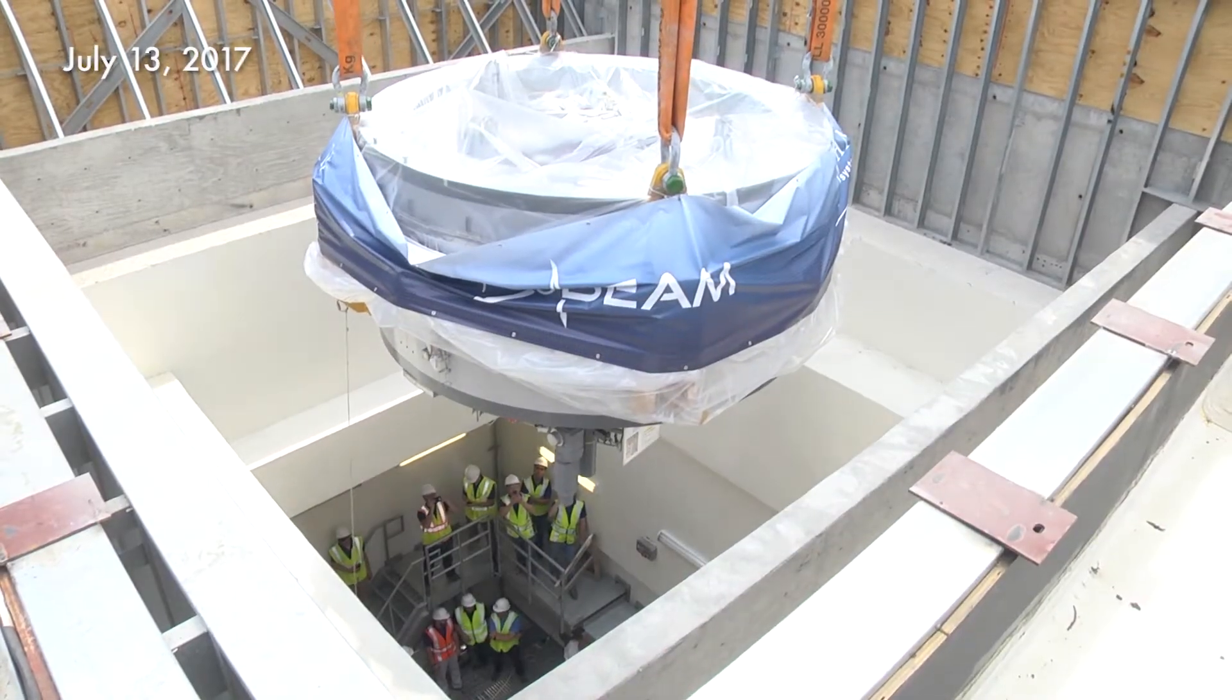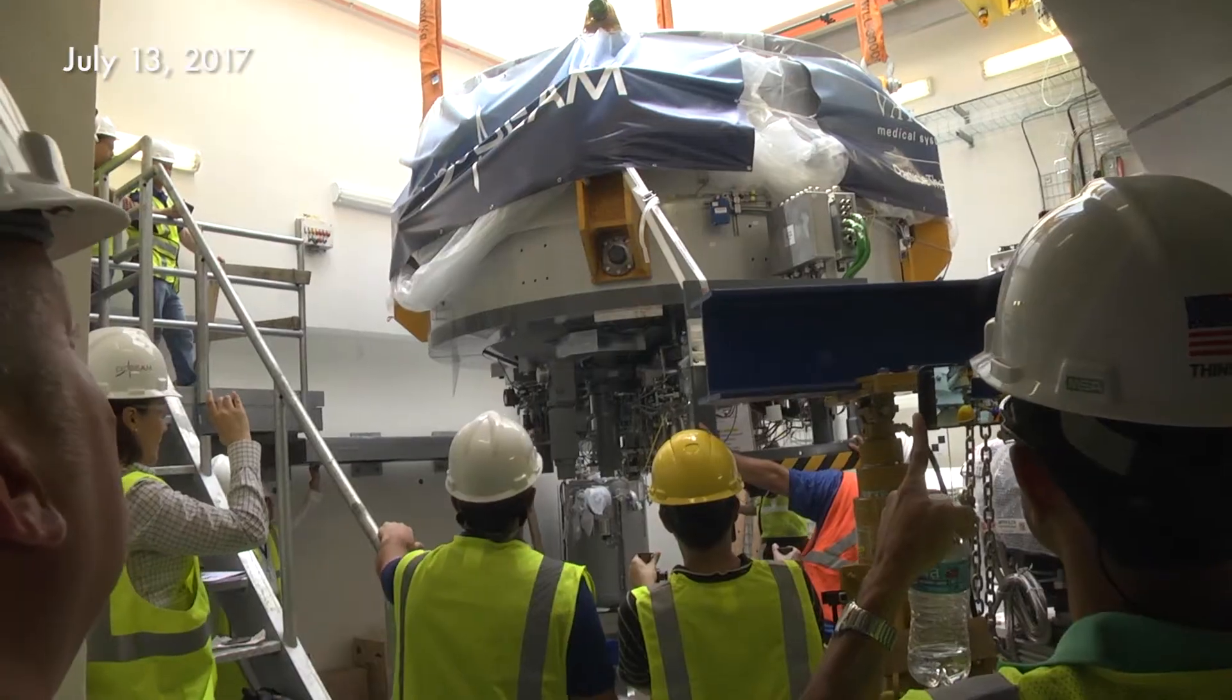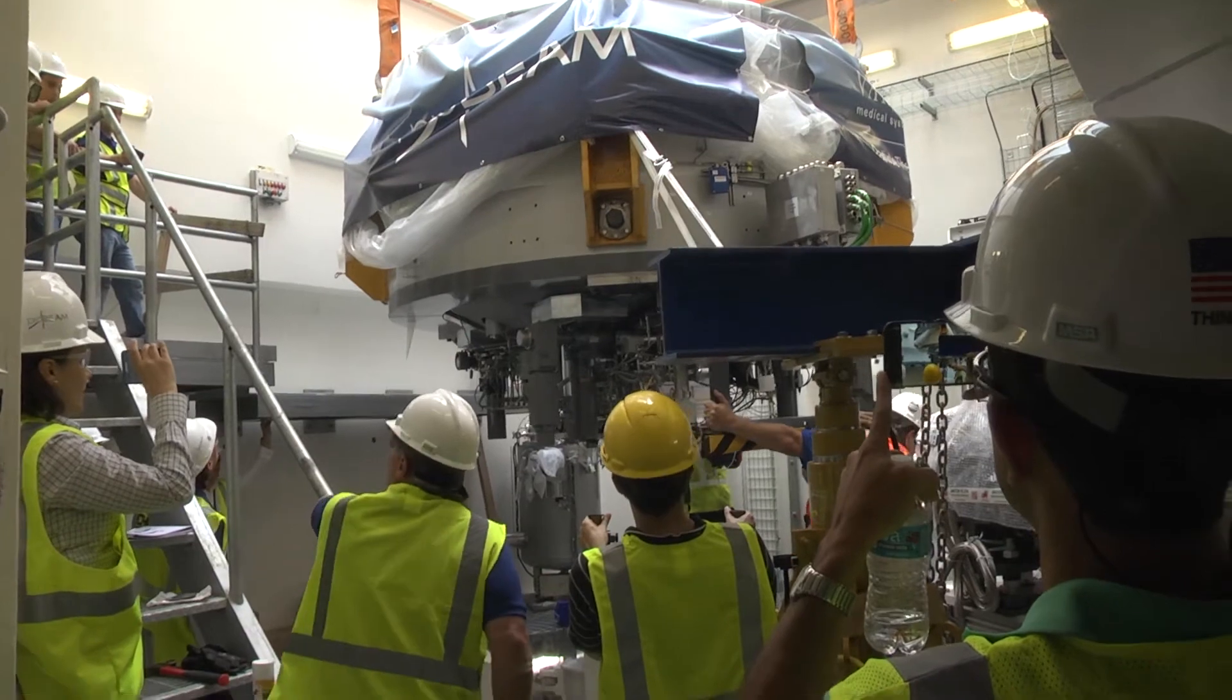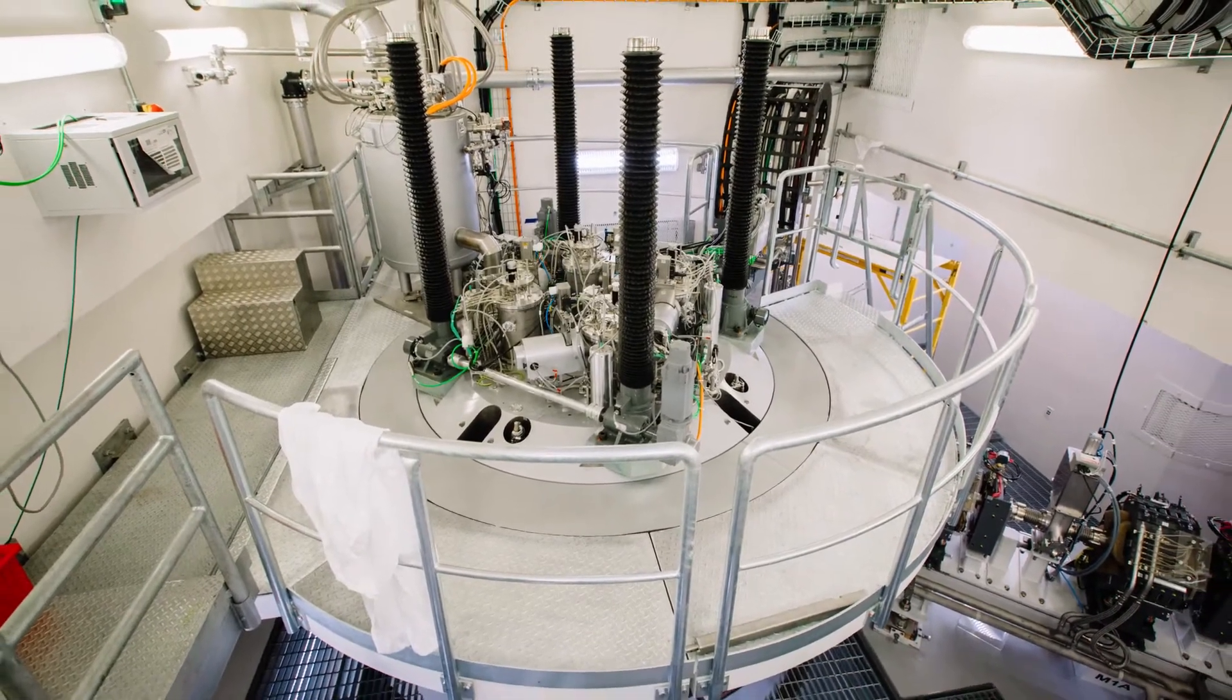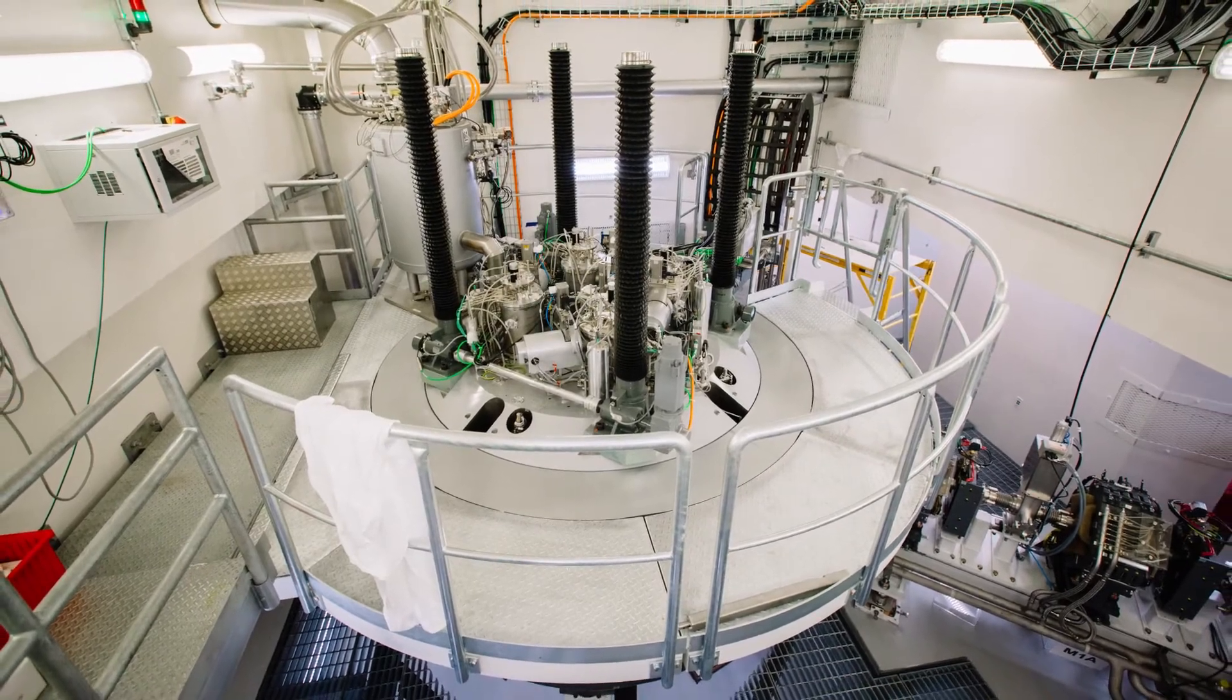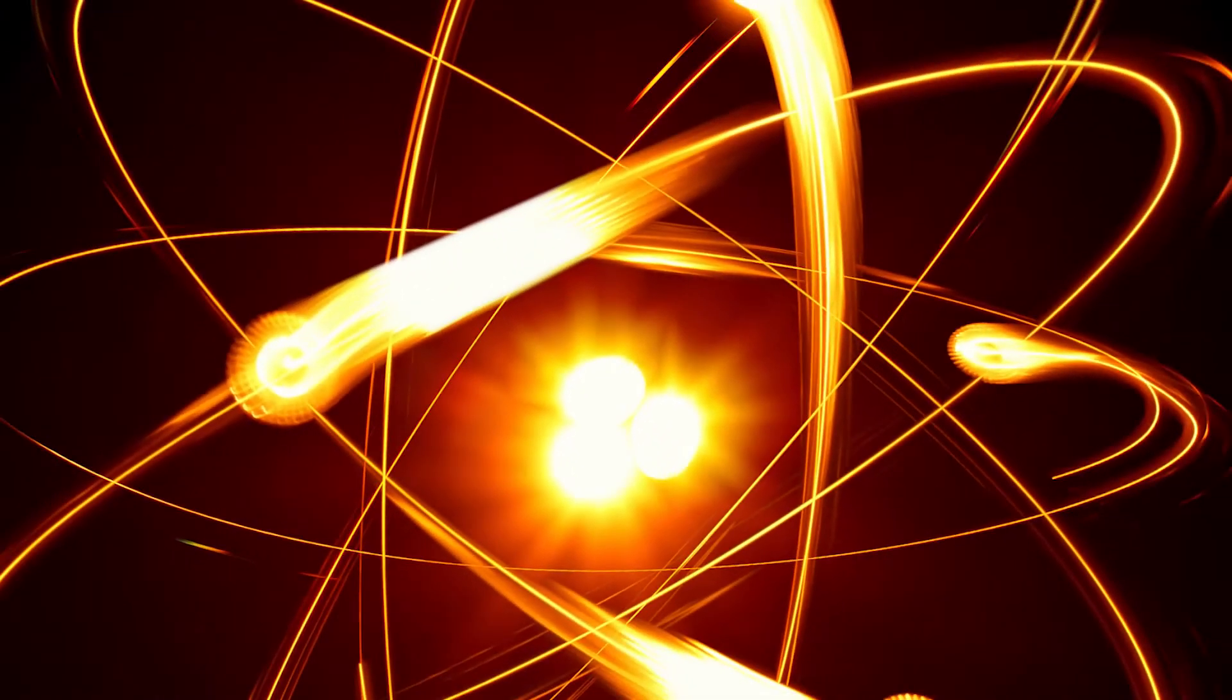This is the state-of-the-art superconducting cyclotron. The cyclotron is a particle accelerator that uses electromagnetic fields to speed up proton particles in an outward spiraling path, producing the proton beam used for treatment. A proton is a positively charged particle found in the nucleus or center of atoms.